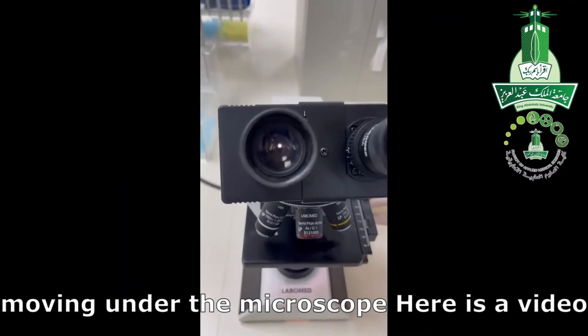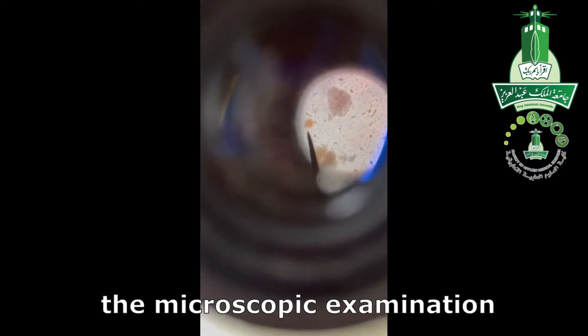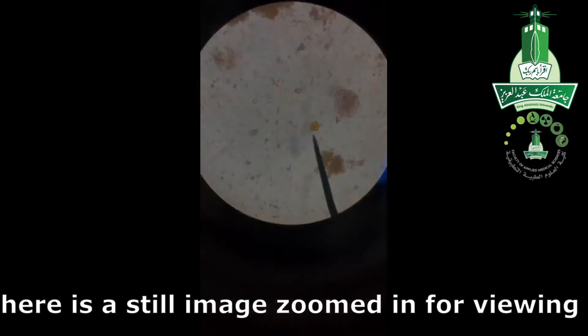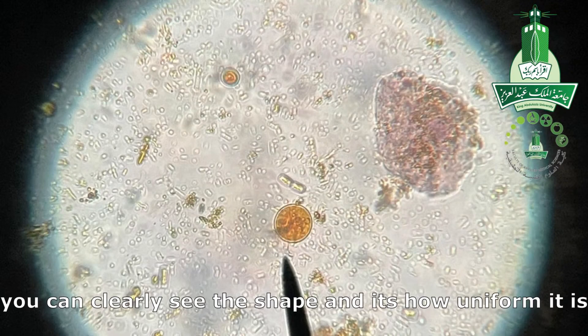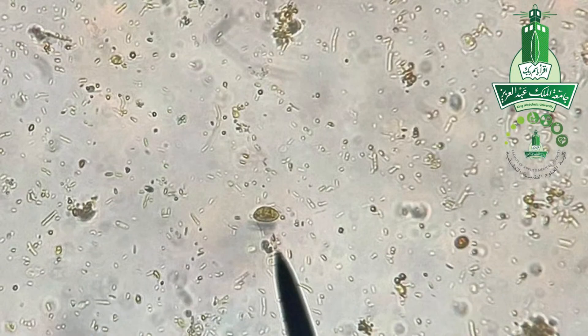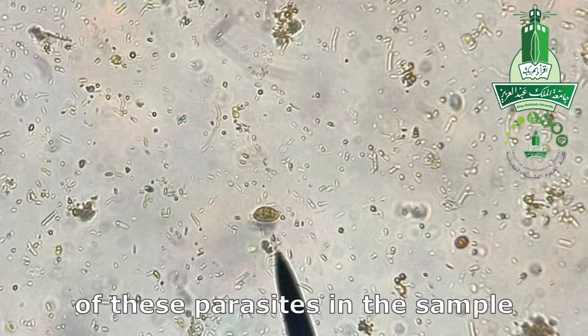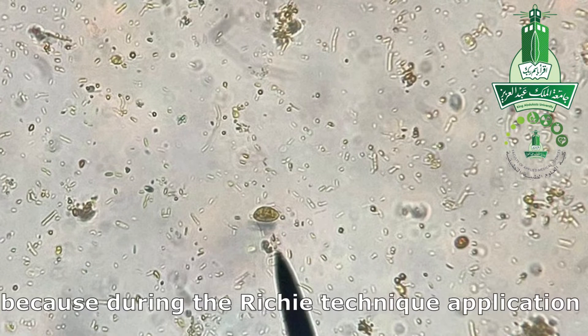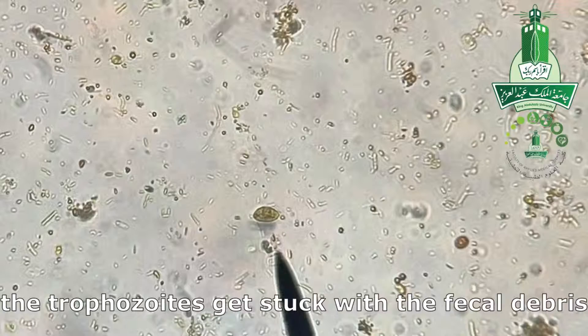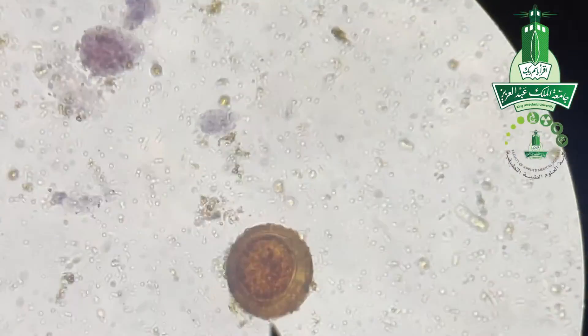Here is a video of E. coli detected during microscopic examination, along with a still image zoomed in for viewing — you can clearly see the shape, how uniform it is, and the nucleus. Here is another finding of Giardia. Note that you cannot see trophozoites of these parasites in the sample, because during the Ritchie technique application, the trophozoites get stuck with the fecal debris. Here is also a finding of Ascaris egg.